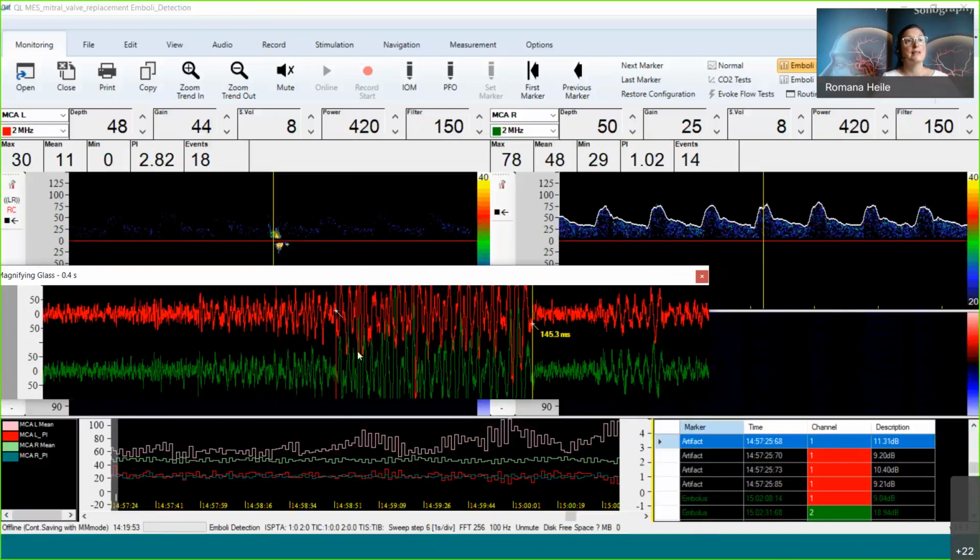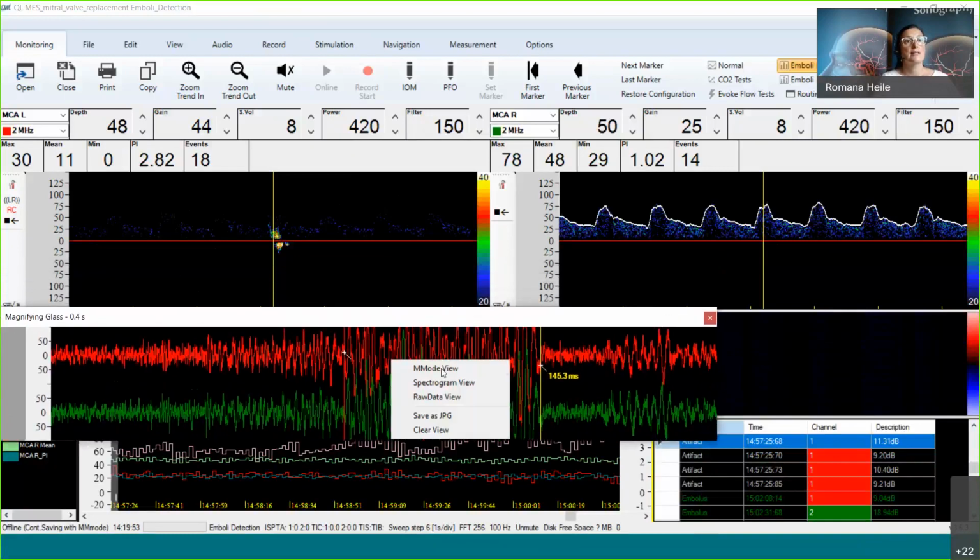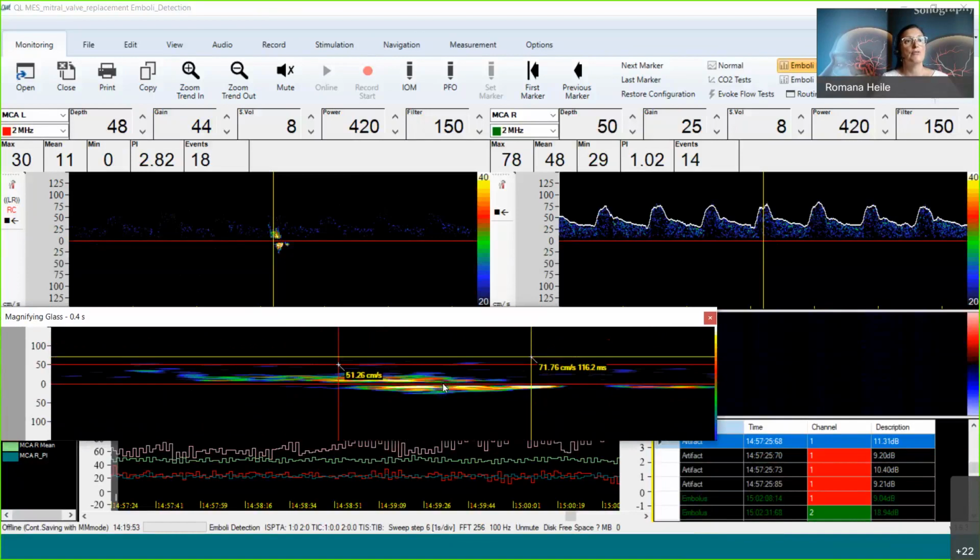And it's not really identical, it's just the up and down. Let's have a look at the spectrogram. Here you see it's very long. It's too long to be a short-term event, and it's above and below the zero line at the same time. Correctly identified.